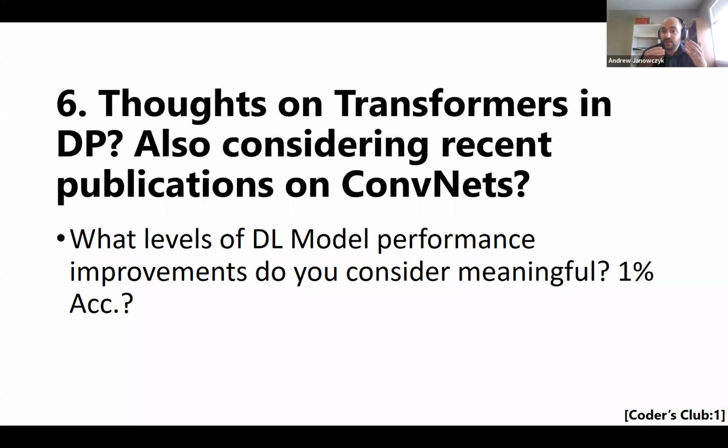So nowadays, I'm also looking for a standard deviation and saying, well, we're always within this band. That is additional evidence that would make me feel more confident. But for me nowadays, if it's not at least a 5% improvement, I'll read the paper, but I probably won't pay for the technology. And that's in absolute performance, not relative performance.